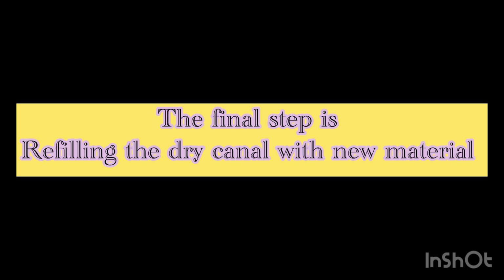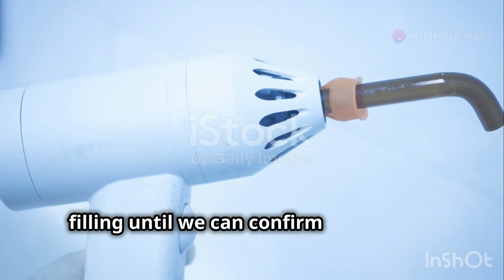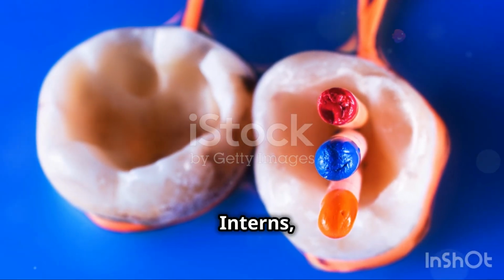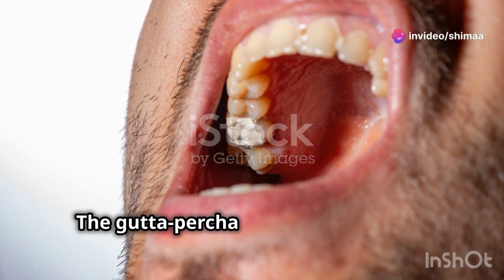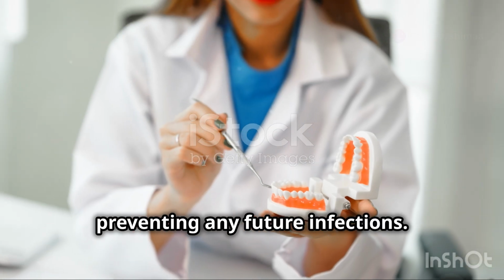We obturate the canal using gutta percha and a suitable sealer. Then restore the tooth with a temporary filling until we can confirm the healing at the follow-up appointment. Observe the obturation technique closely. The gutta percha and sealer ensure a tight seal, preventing any future infections.